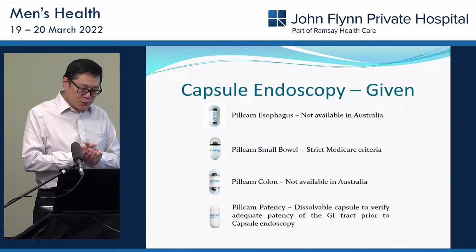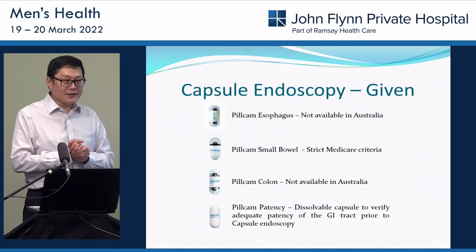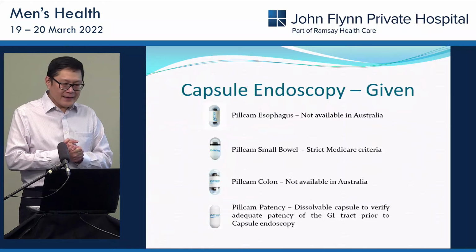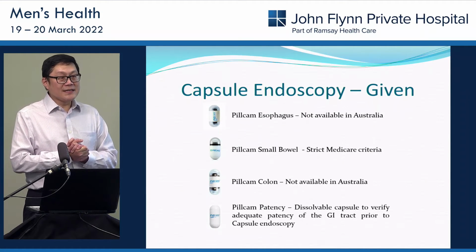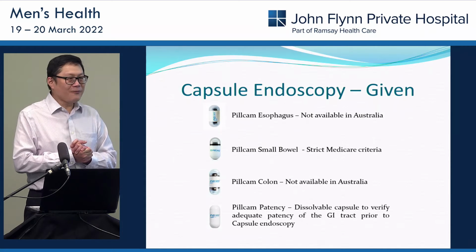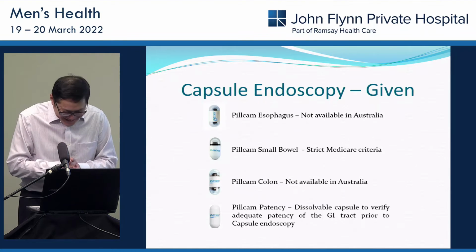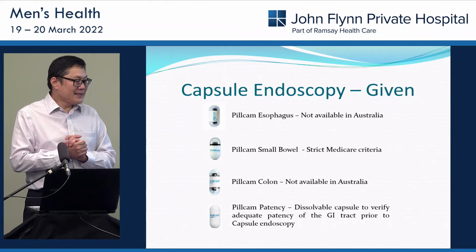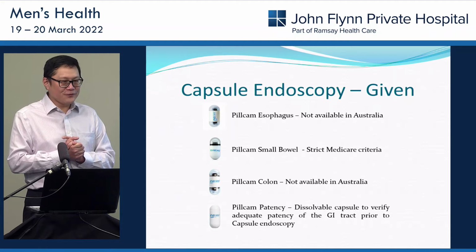In order to perform the PillCam colon, the patient has to swallow the capsule orally and then continually take bowel preparation to flush the capsule through the small bowel so that it can reach the colon with enough battery left to make a recording. And furthermore, it's interesting to know that the capsule doesn't travel in a linear fashion. It just goes back and forth, tumbling here and there, and most of the time you don't even know where you are. And I think the bowel preparation is 3 times worse than having bowel preparation for colonoscopy.